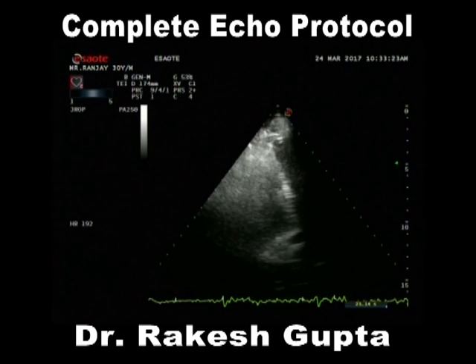If you have to look for wall thickening abnormalities, you have to spend some time looking at 4-chamber, 2-chamber and 3-chamber views. Without that, it is not possible to comment on wall thickening abnormalities. Use the aid of respiratory movements, whether these images are seen better with or without inspiration. Are we clear about this?